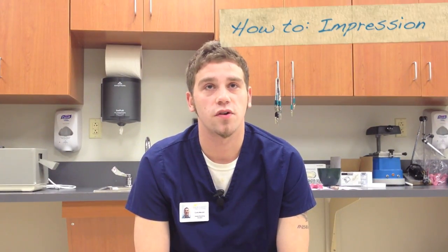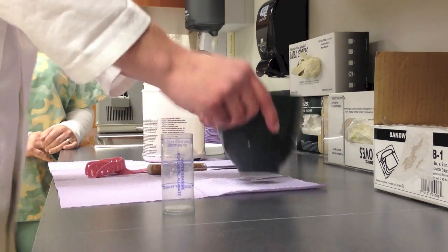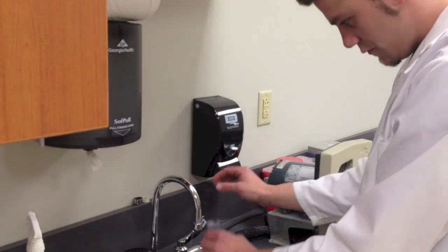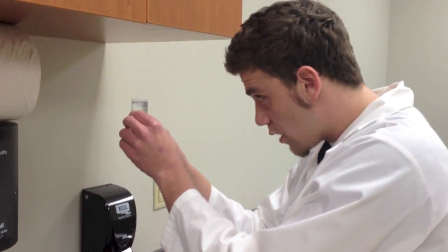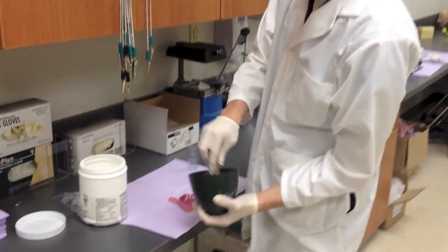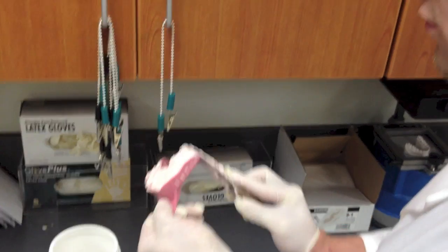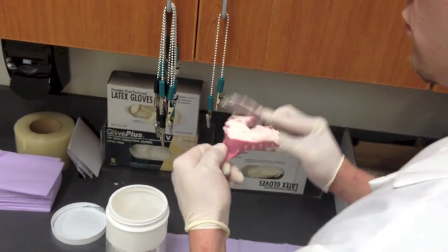For the dental impressions, first you need a bowl and then you need three scoops of alginate. Then you fill the water up to the top line, dump the water into the bowl, and mix it in a motion. Smooth it out, flat it out until it feels like icing.